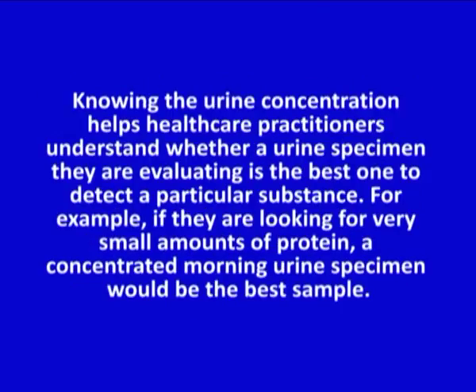Knowing the urine concentration helps healthcare practitioners understand whether a urine specimen they are evaluating is the best one to detect a particular substance. For example, if they are looking for very small amounts of protein, a concentrated morning urine specimen would be the best sample.